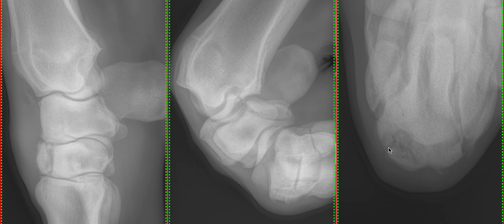With the fracture, we've got a semi-circular line going through the radial facet of the third carpal bone, but we've also got some smaller lines radiating palmarly, which is quite common. Sometimes those can radiate a lot further palmarly than we think, and if we did a CT study on this limb, it may well reveal additional fracture lines going further palmarly. On the flexed lateral medial view, we can see a little bit of new bone on the dorsal proximal aspect of the third metacarpal bone and also on the third carpal bone.